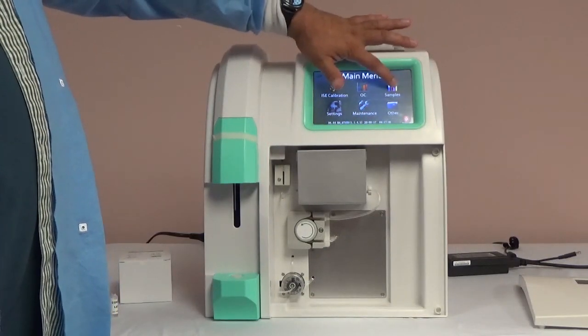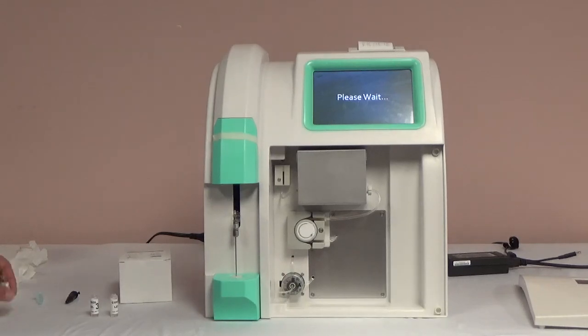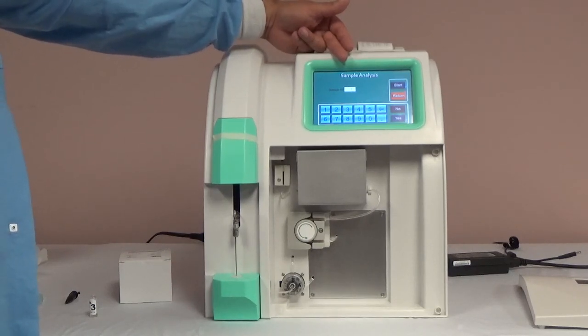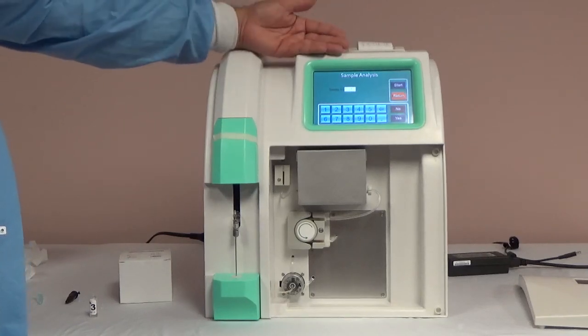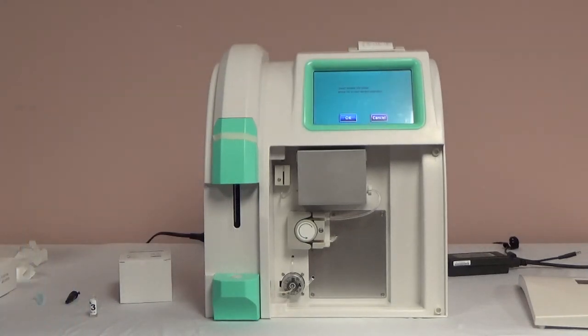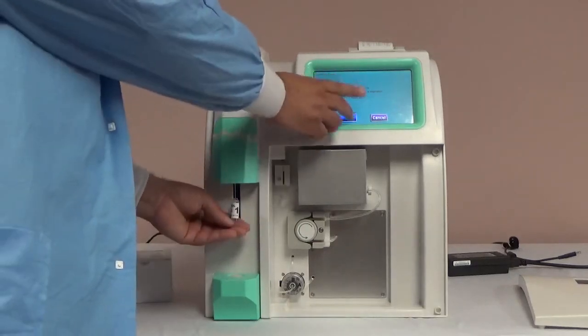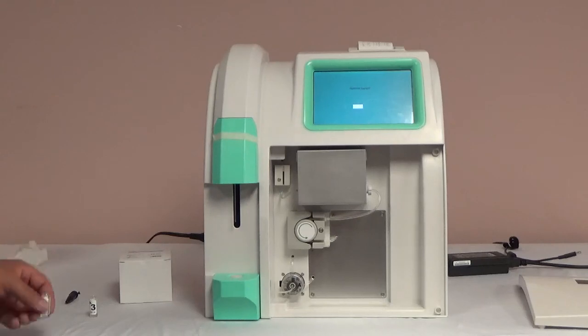To begin running samples, select the sample screen from the main menu. The sample process is very similar to the QC process. Once the analyzer is ready, you can enter the sample ID — a unique ID or leave it at 1. Note that it will label the samples consecutively based on the number you enter. The analyzer will ask that you insert the sample onto the probe, press OK, and remove the sample when prompted. The analyzer will process the sample and show you the results on the screen as well as print them out. Repeat the process of sampling when ready.